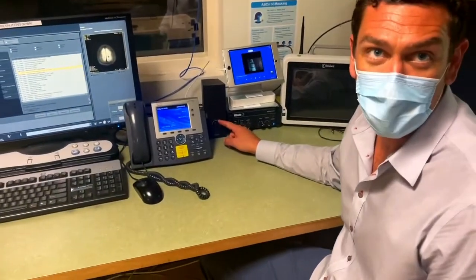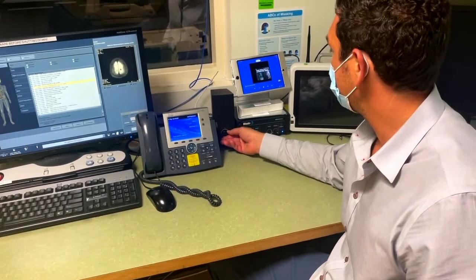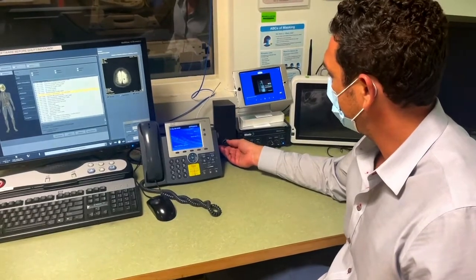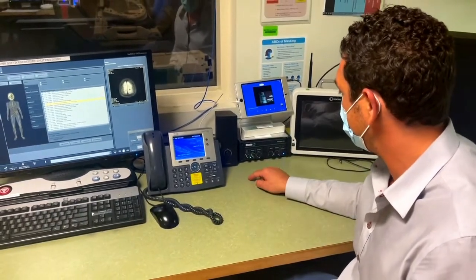The technologist speakers allow the technologist to listen to what the patient is listening to and have their own individual volume control that does not affect the patient's listening experience. You can turn the music up or down without changing the volume in the headphones. Everything on the face of the amplifier is for the patient.